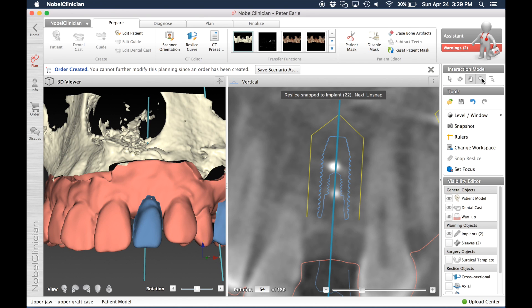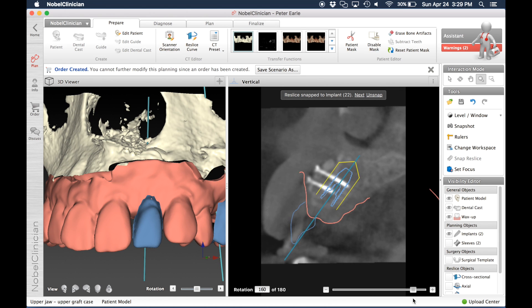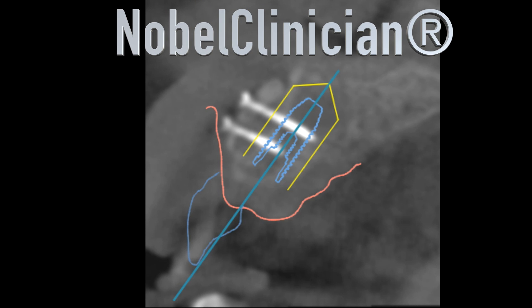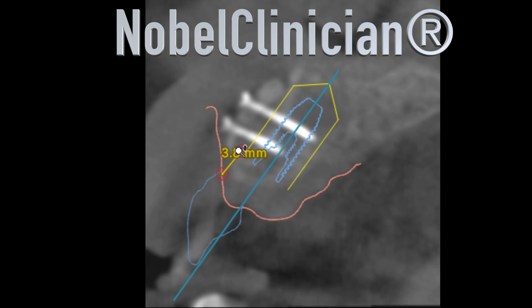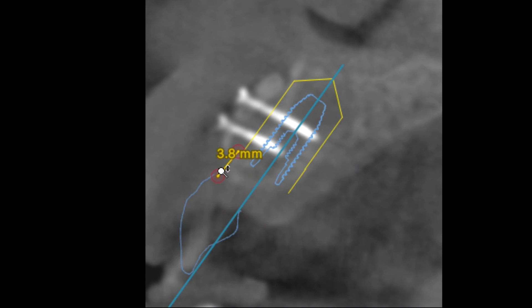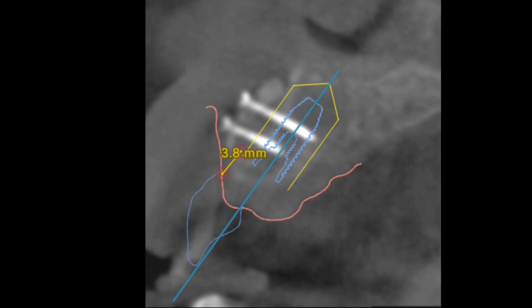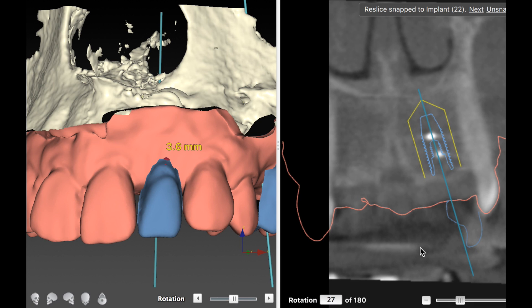During the placement of this lateral it will actually be subcrestal — so we won't be at bone level. If we were at bone level, the prosthetics would not look proper. We have to be slightly below, maybe one to two millimeters below the bone level. Once the screws are taken out, we'll use a template to guide the surgery and get the implant in deep enough — going to about three and a half millimeters. We're measuring the depth from the prosthetics, which is the free gingival margin. We can see the blue temporary crown here — the wax up — so we'll go down about 3.5 millimeters, and by doing so we can generate a surgical template.